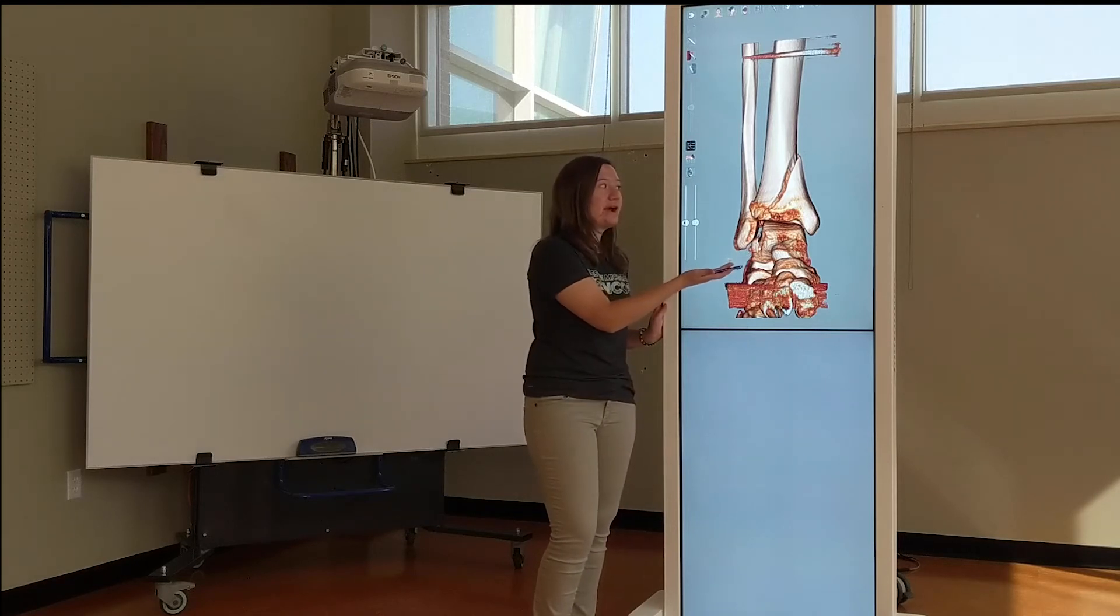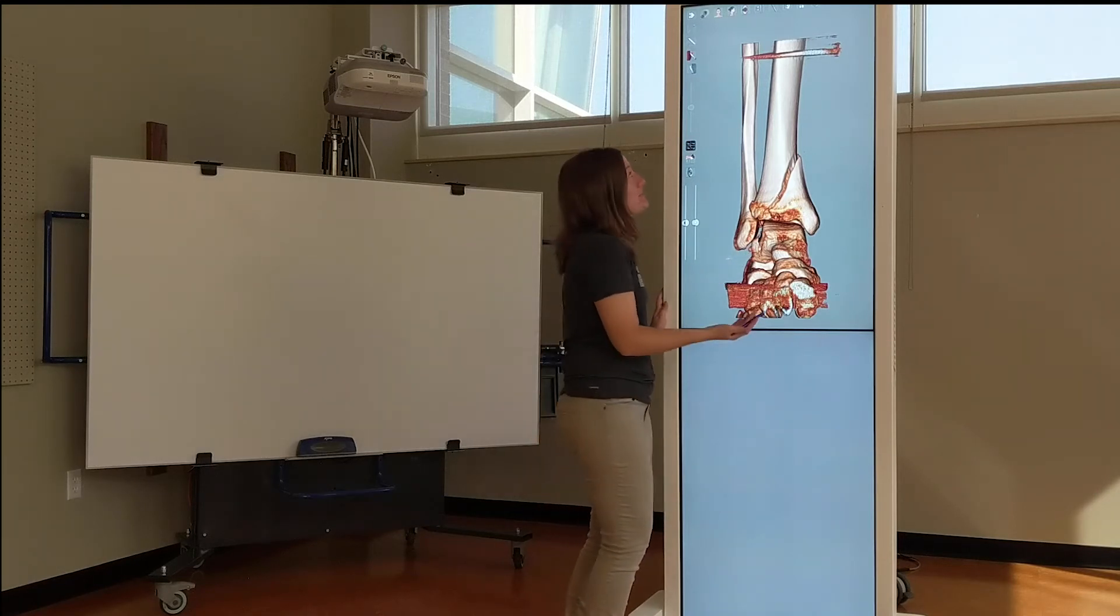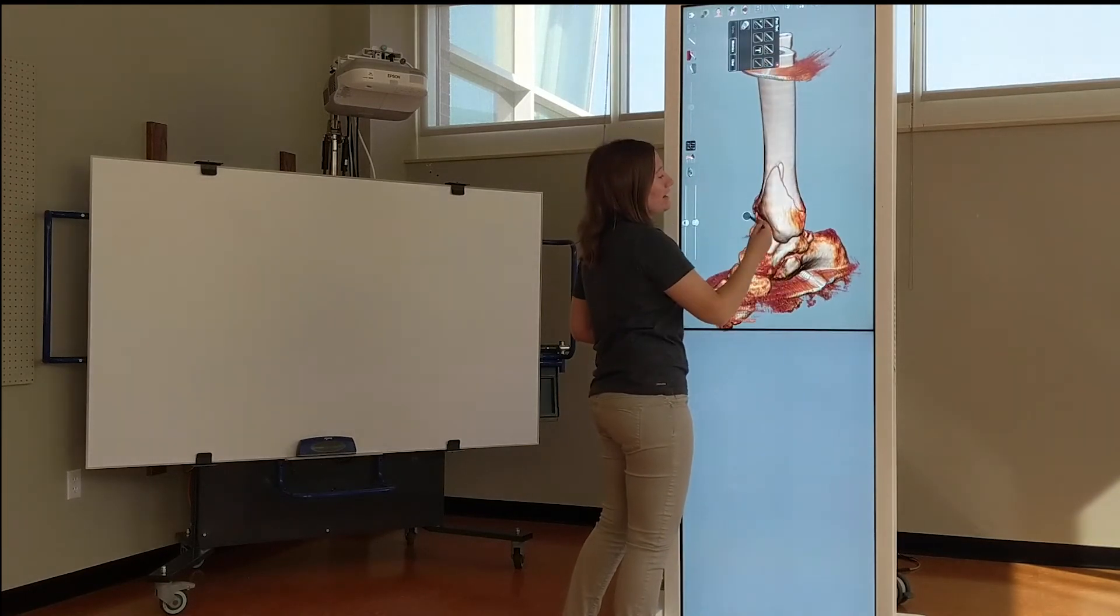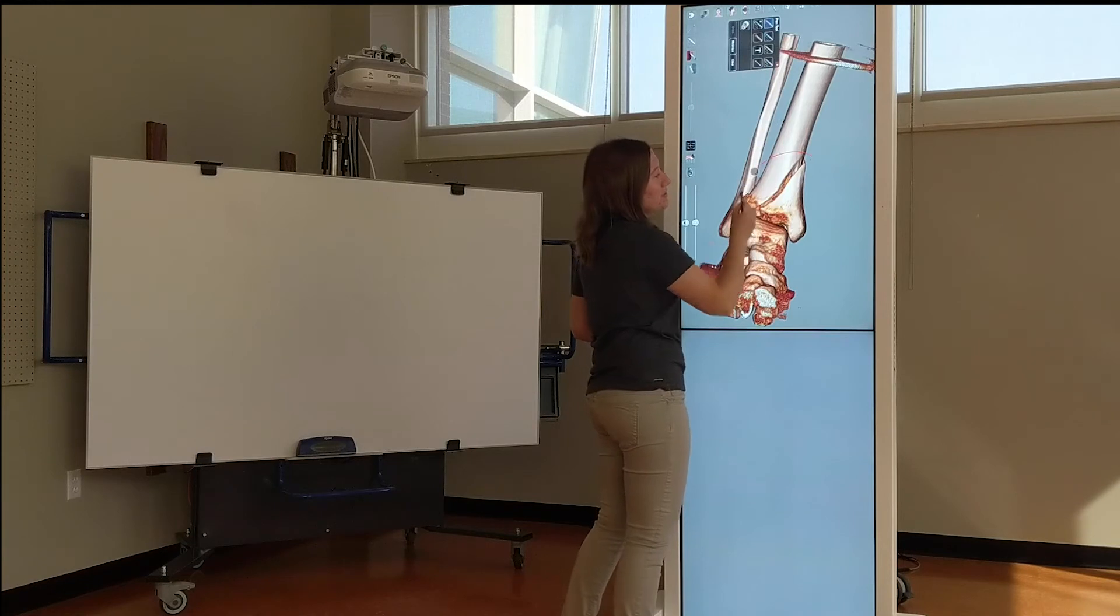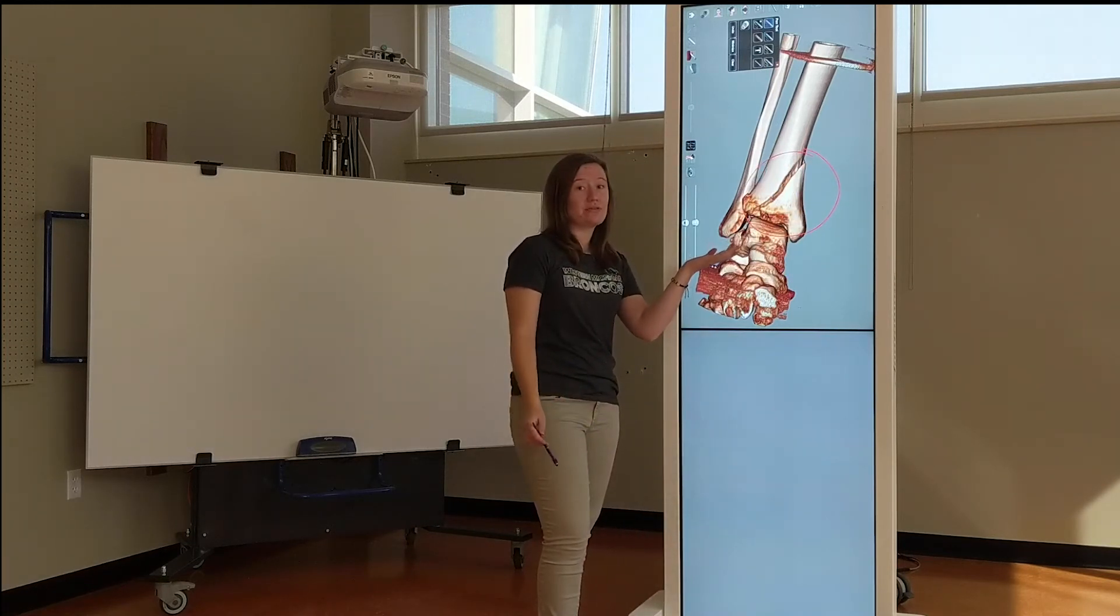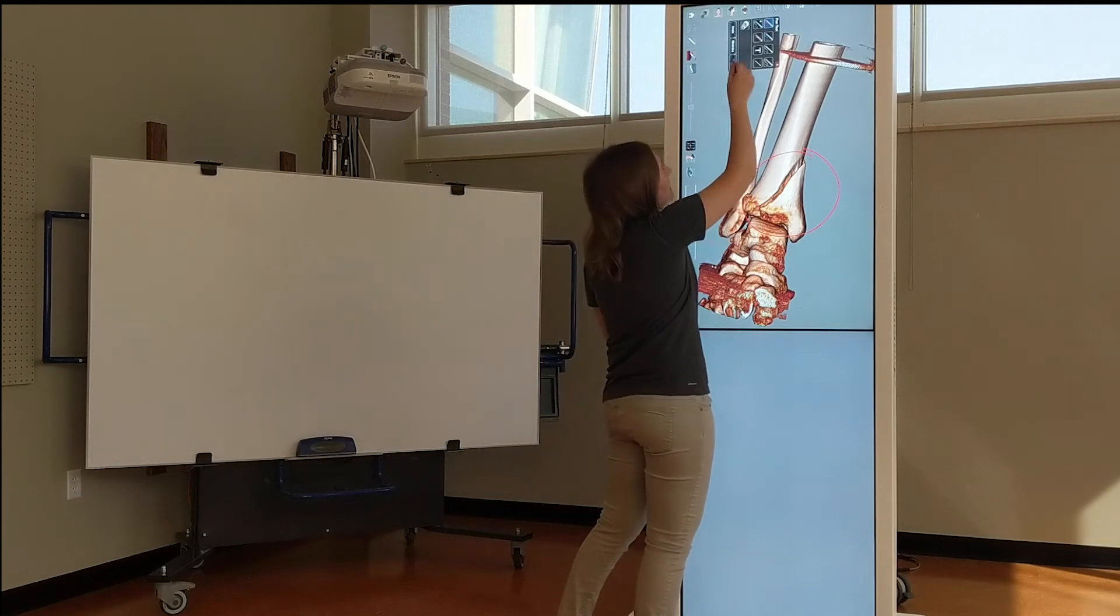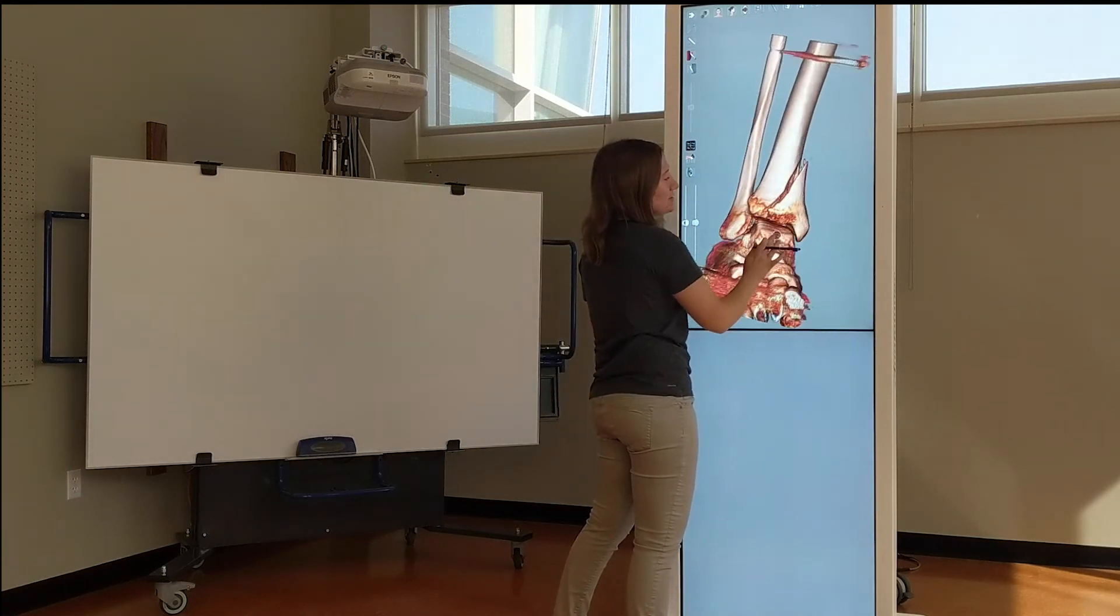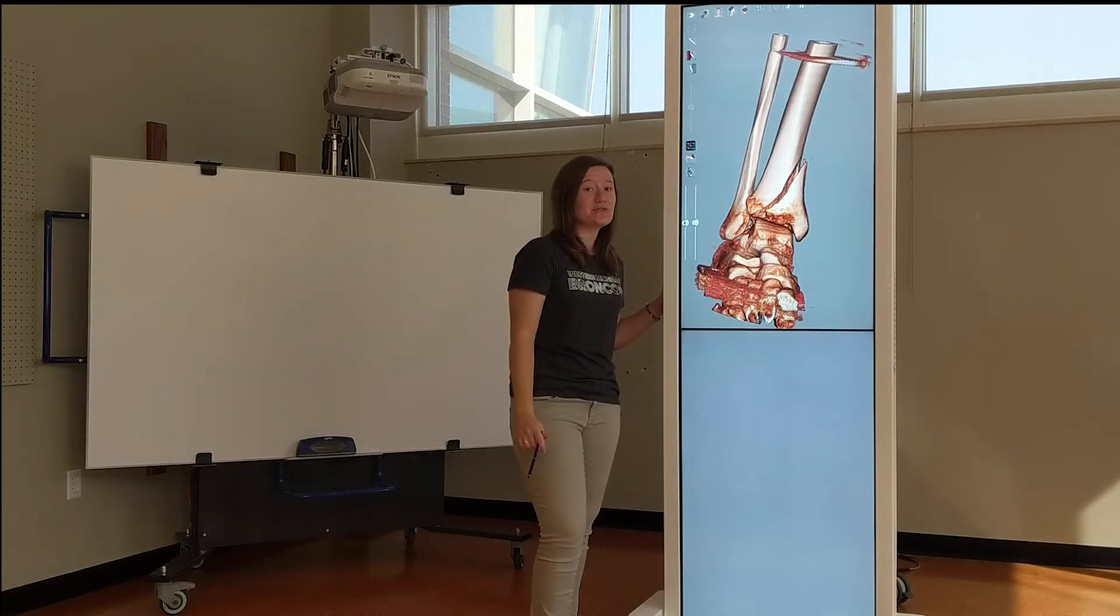Here is an ankle fracture. What's nice about the table is you can draw on it and you can move it around. So I've drawn a circle around the fracture. You can also undo that or move it around so that you can see it. This is really useful for studying.